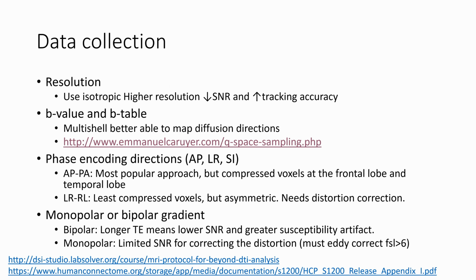That's similar to what you get with the higher resolution: you start to increase your accuracy as you map out those fibers, but you also lose your signal to noise. And the way you experience it in the scanner is it also gets more shaky. You do a B value of 1000, and it's not too bad to be in there. You get 2000, 3000, it starts to shake and it's pretty darn loud. As you get higher and higher, it gets more and more shaky and a fuzzier image, and you get more chance of nerve stimulation.